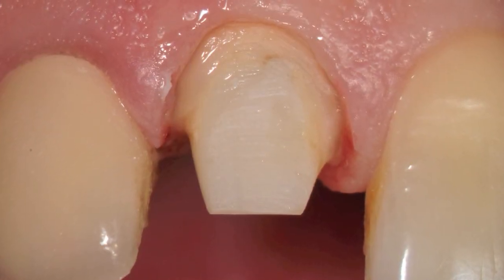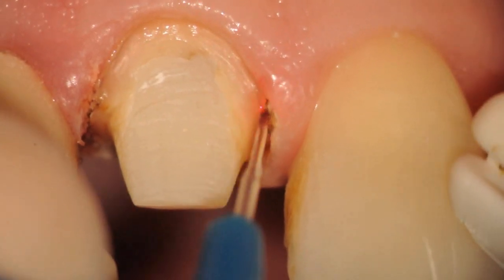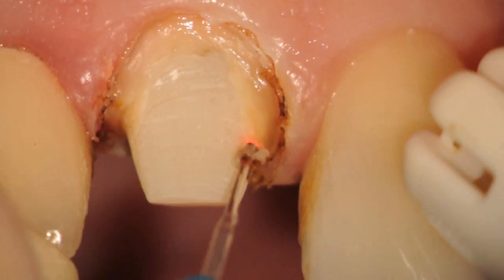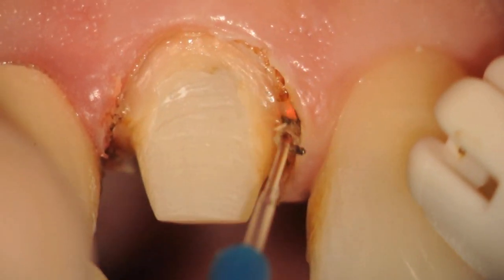You can see the preparation, and the diode laser is brought in — in this case at 0.8 watts. Short brush strokes are taken to create a sulcus, or a moat in the sulcus, going back and forth with short brush strokes and periodically cleaning off the tip.